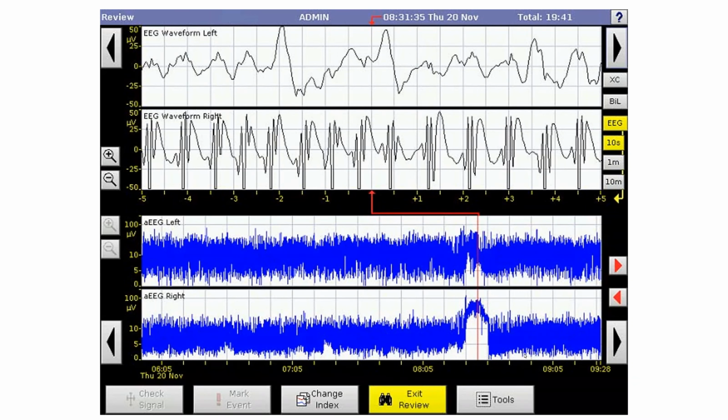So we're looking for a rise in the upper and the lower margins. We're looking for a thinning of that voltage, a thinning of the band, representing that the voltage itself is actually becoming more similar.